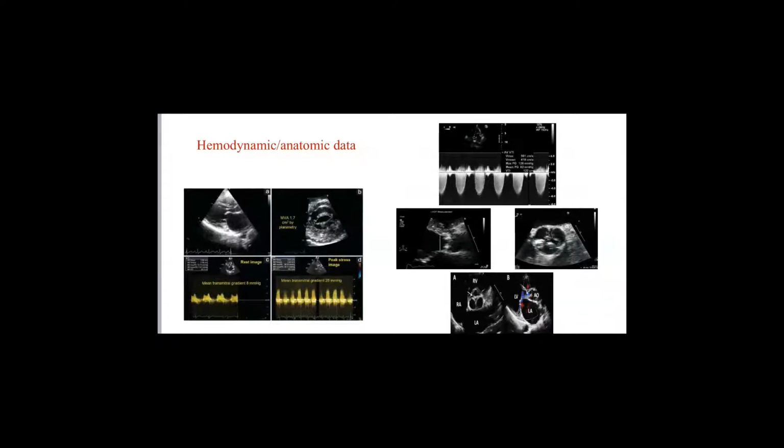But I only disagree with Moawiya on one point: the morphology is so unlikely to deceive you. The morphological data should always be your frame of reference. So the data that you are gonna fall back upon is the morphological data. And you have to look at the hemodynamic data in this light. Does it make sense in the light of the morphological data or not? So you judge the hemodynamic data standing on the anatomical data and not vice versa.